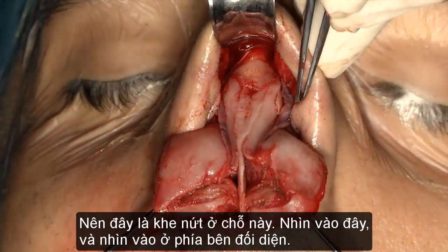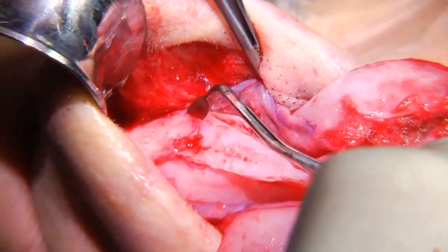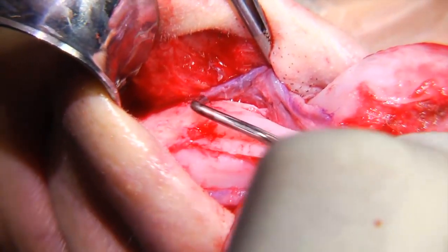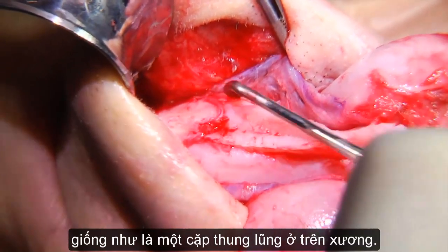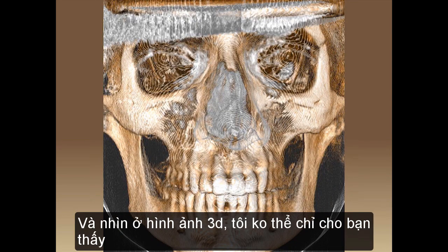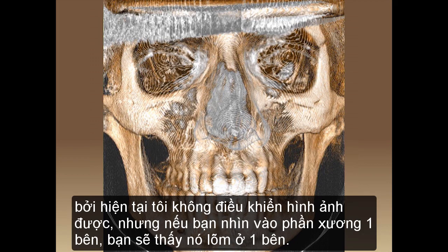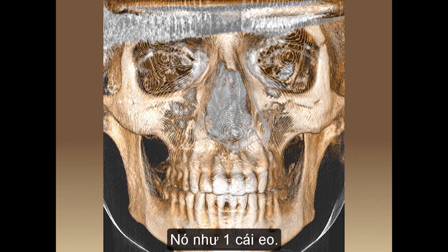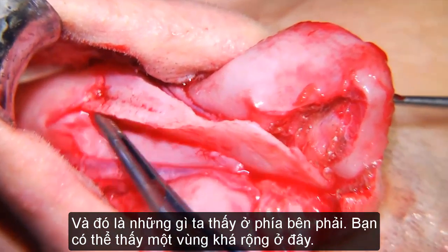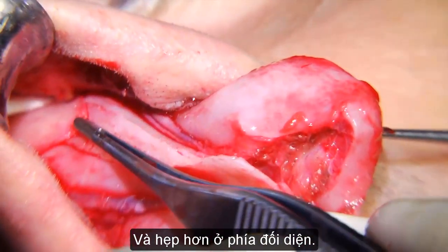See the way, in a moment put up the 3D with the bone in front. See the way this bone is shaped with a couple of nooks. It's like a couple of valleys in the bone. And see the render, the 3D imaging. I can't point it out to you because I don't have control of that image, but if you look at the bone, you see there's a valley to one side. It's like an isthmus, and another one on the other side. And that's what we see on the right. You can actually see a wider one here and a narrow one on the other side.